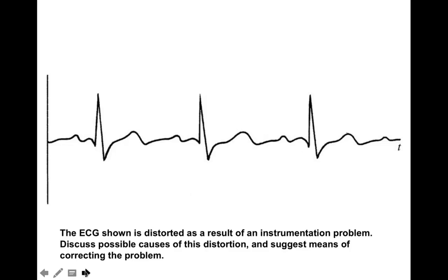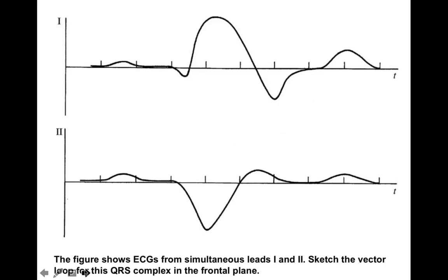Usually the machine will tell you that your ECG is abnormal, and before making any conclusions, the person administering the ECG should always check whether there was some potential cause for the distortion that was part of the instrument or user. Here's what it looks like when you just look at lead pair 1 and lead pair 2, and this looks obviously nothing like the ECG that we're used to. So this is just an illustration of the need for multiple locations in order to do this kind of vector manipulation to actually detect the heart rate.